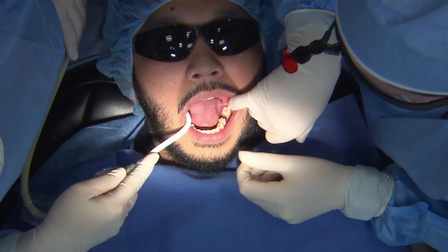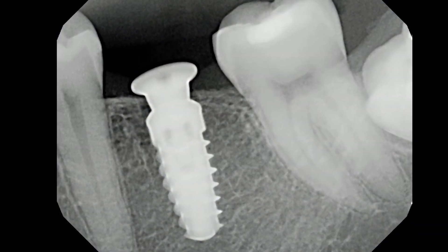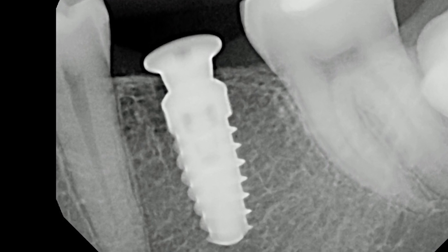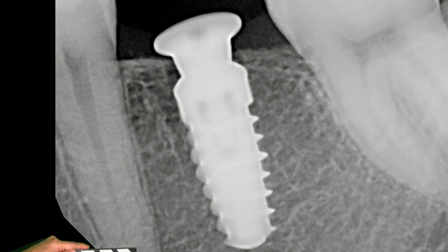We're going to get one final X-ray. You can see the implant is placed in a 2D spatial view — it's placed right where we want it to be, nicely away from our nerve and right in between our teeth. Everything looks pretty good.